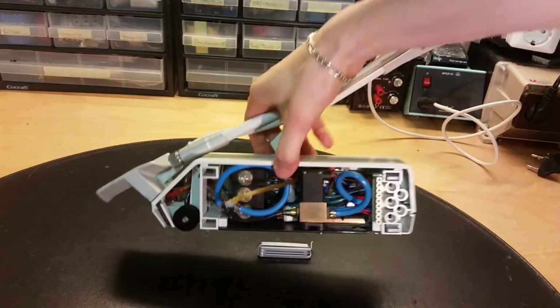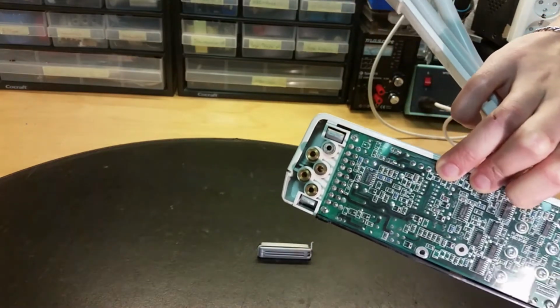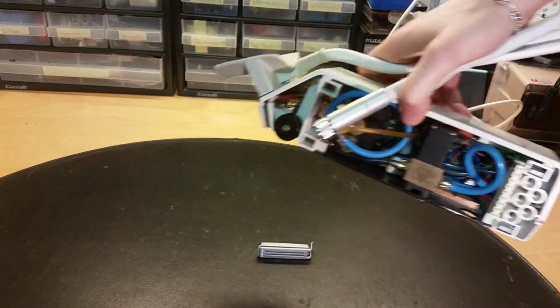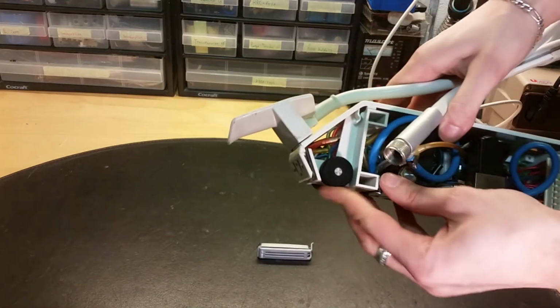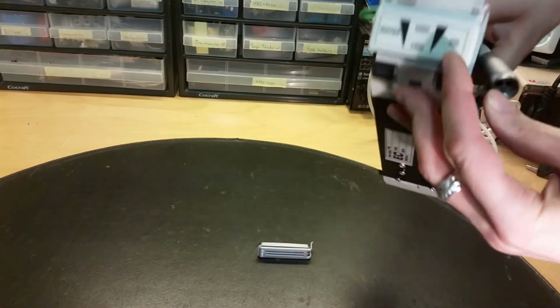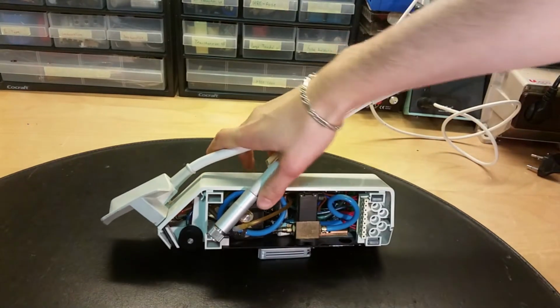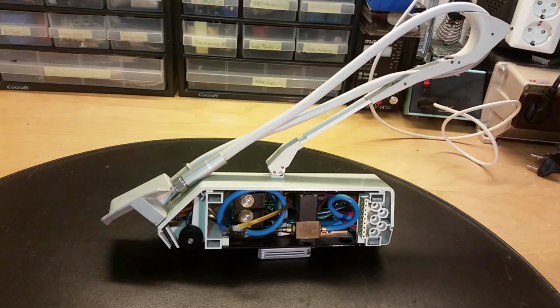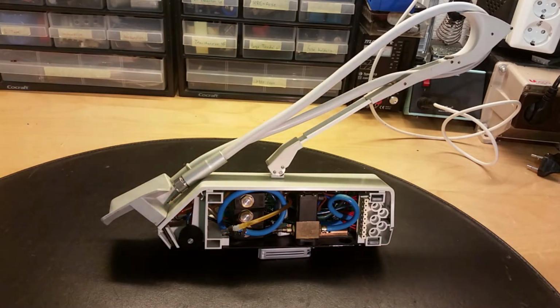So you can connect how many of these you want, or not how many, but like 5 or 6 of these together. These are the terminals, and they're connected to the next module. And we got 2 knobs here, like controlling airflow or water. For example, some of the drills go by air. There is a little air turbine in them, and you use water for flushing out stuff, and for cooling if you have a drill.